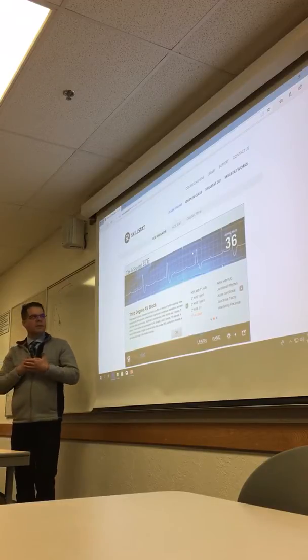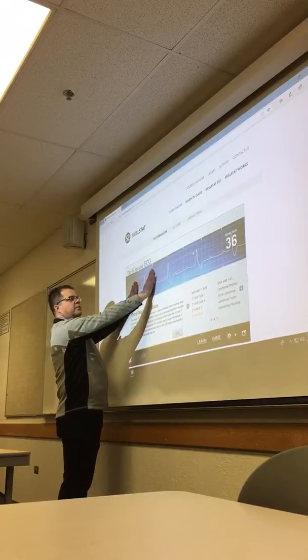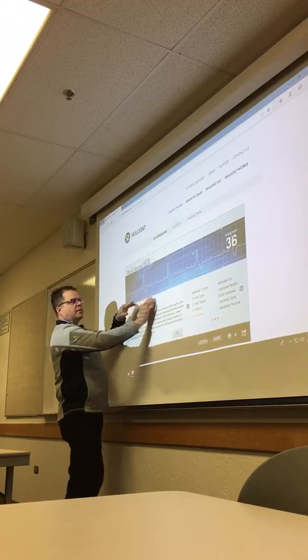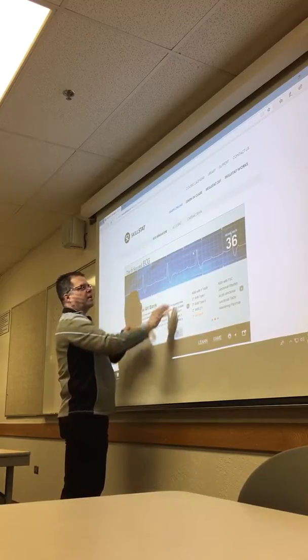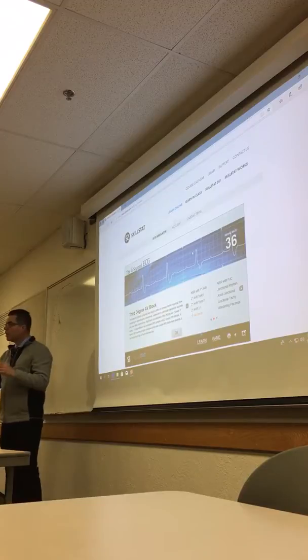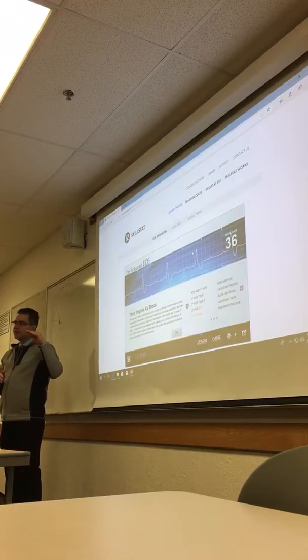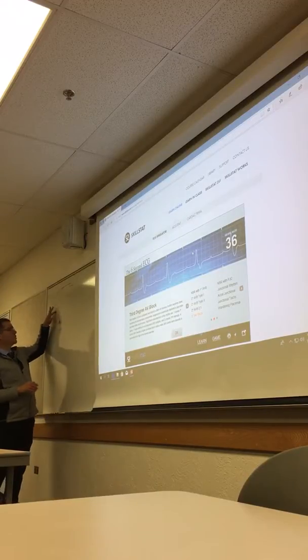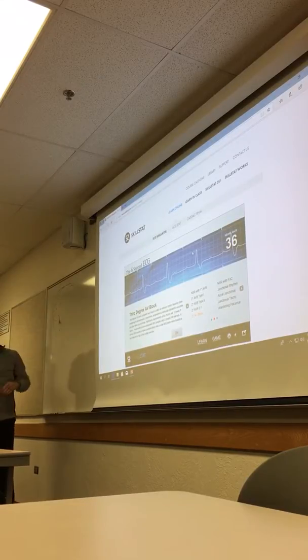Very confusing, okay? But if you were just to look at this, you might think that that was first degree heart block, right? With a prolonged PR or widened QRS, and that looks pretty normal, right? But when you start to put it all together in a strip, you need to look at this with more than a couple of beats. That's why we give you 6 seconds to look at this. Okay? This is third degree. This means that the atrial sinus node is firing differently than the AV node, and there's a complete block. Complete. That's why they call it a complete block.